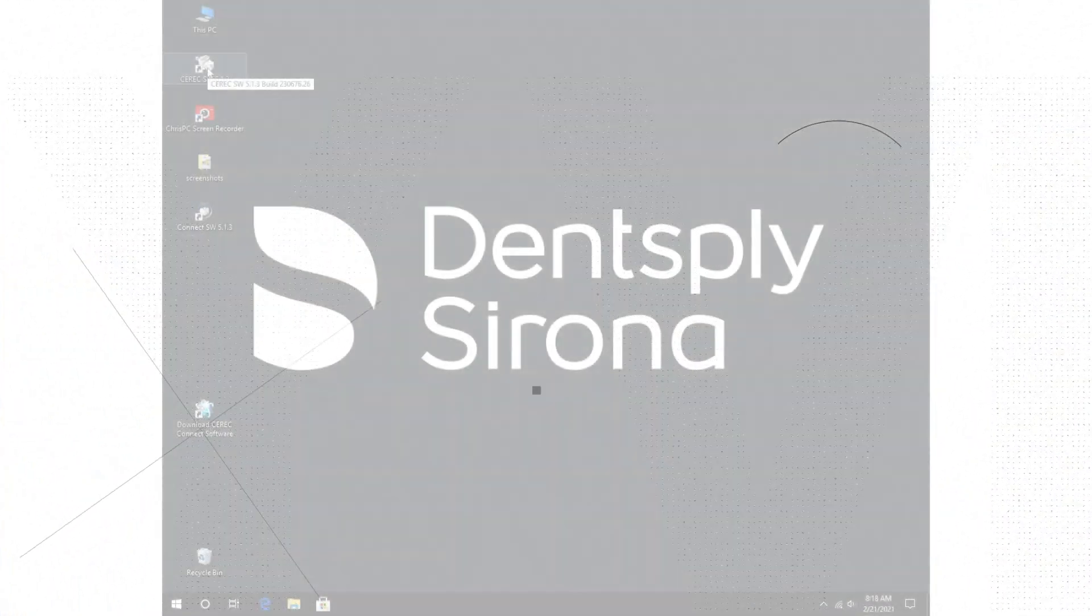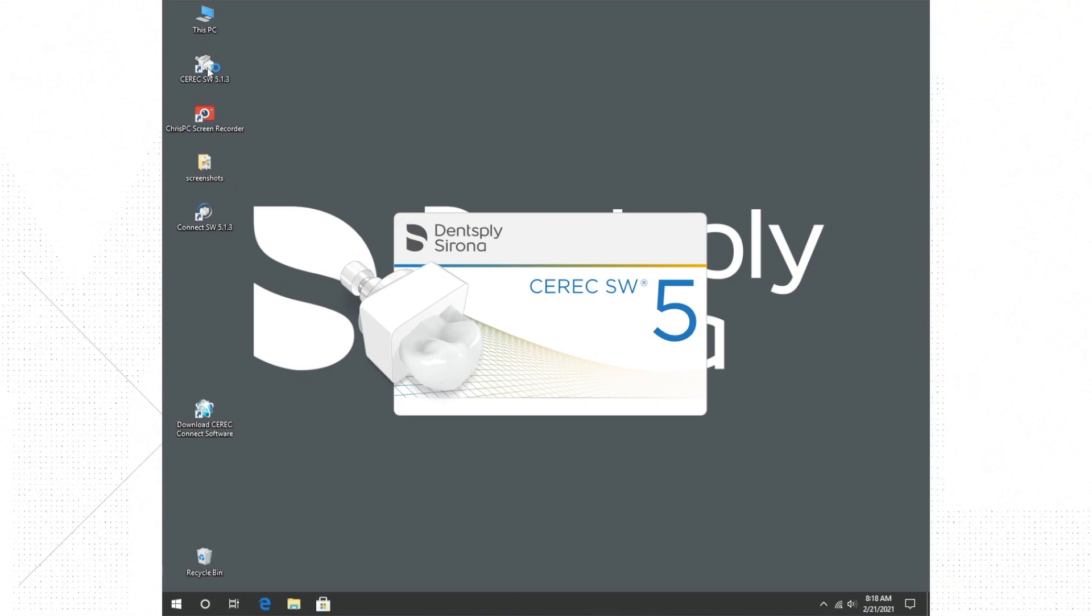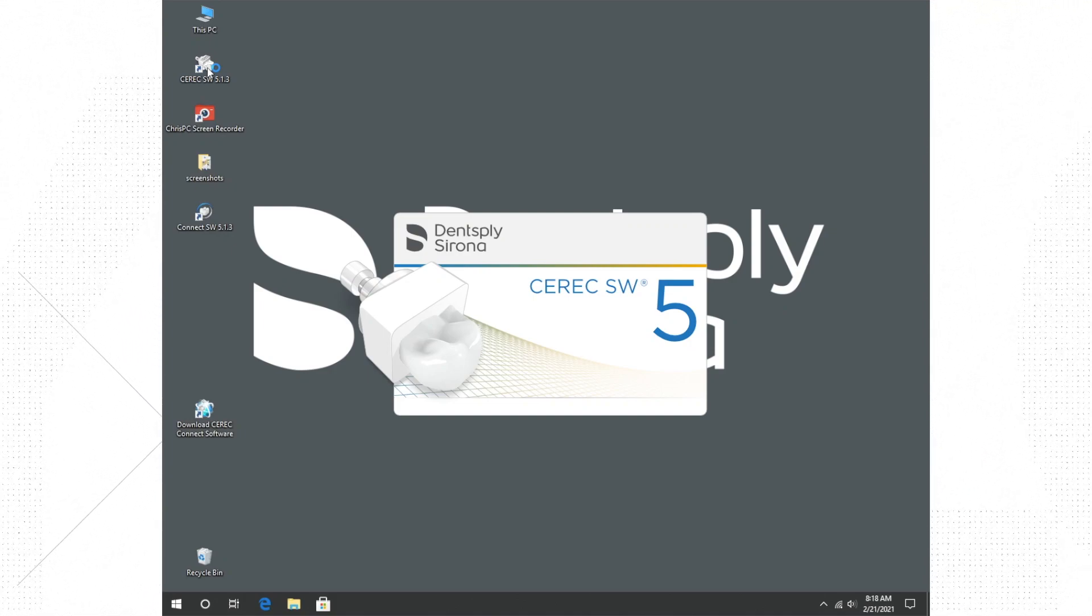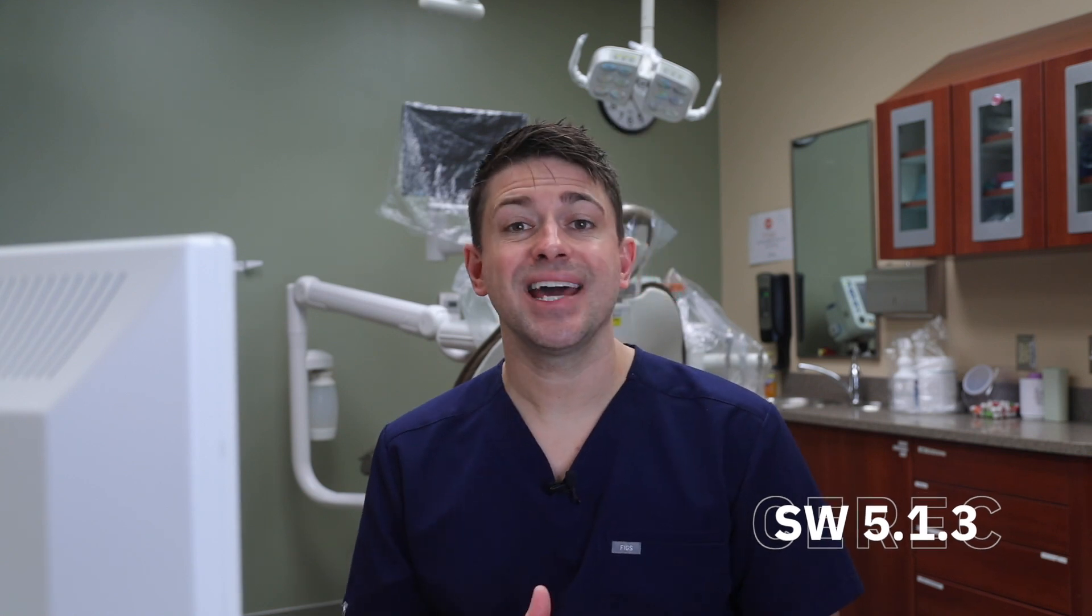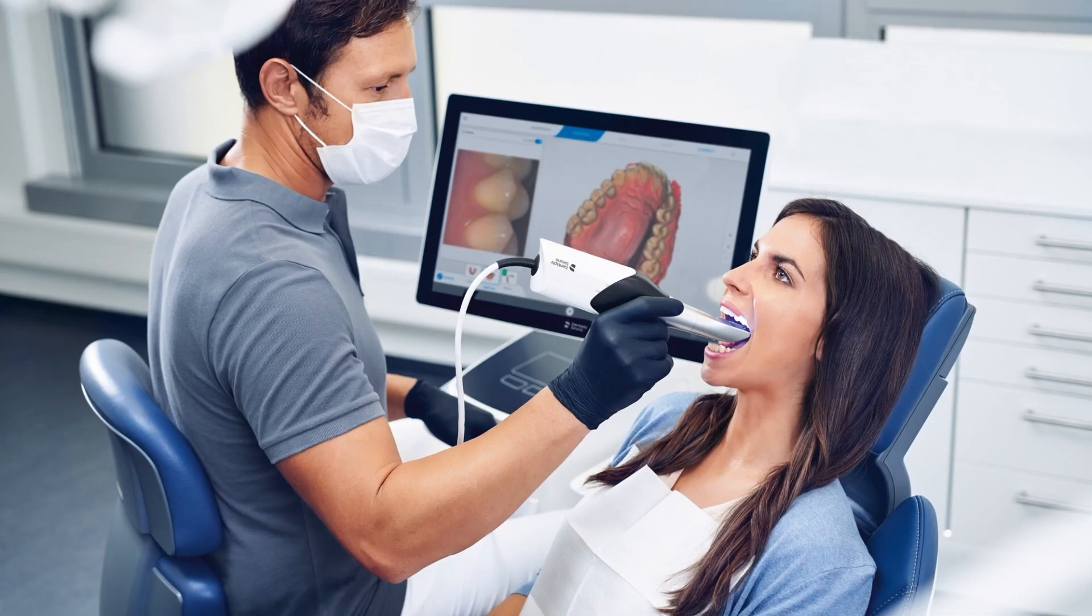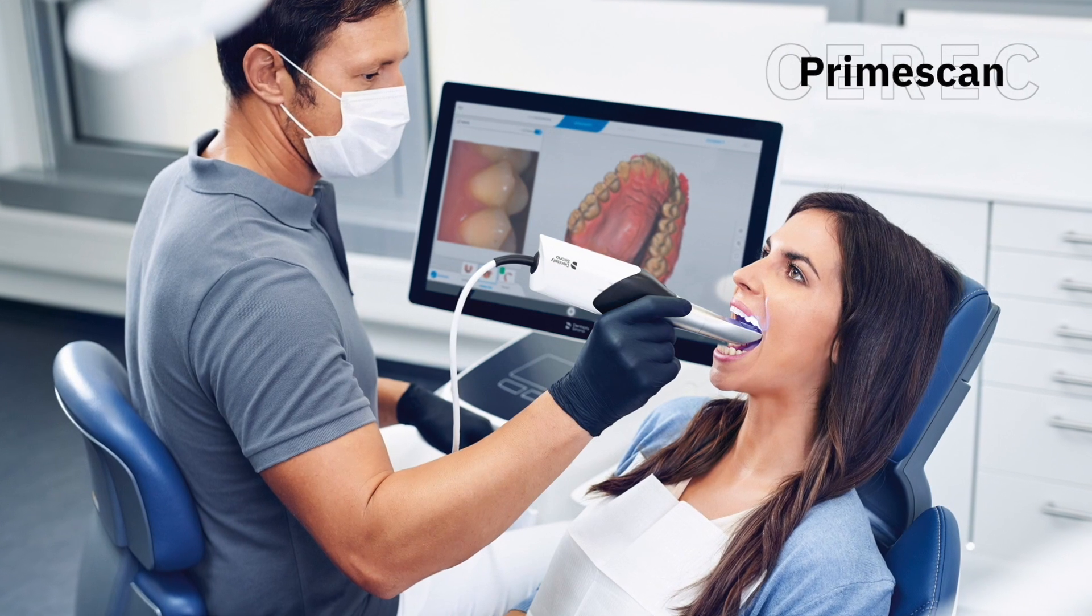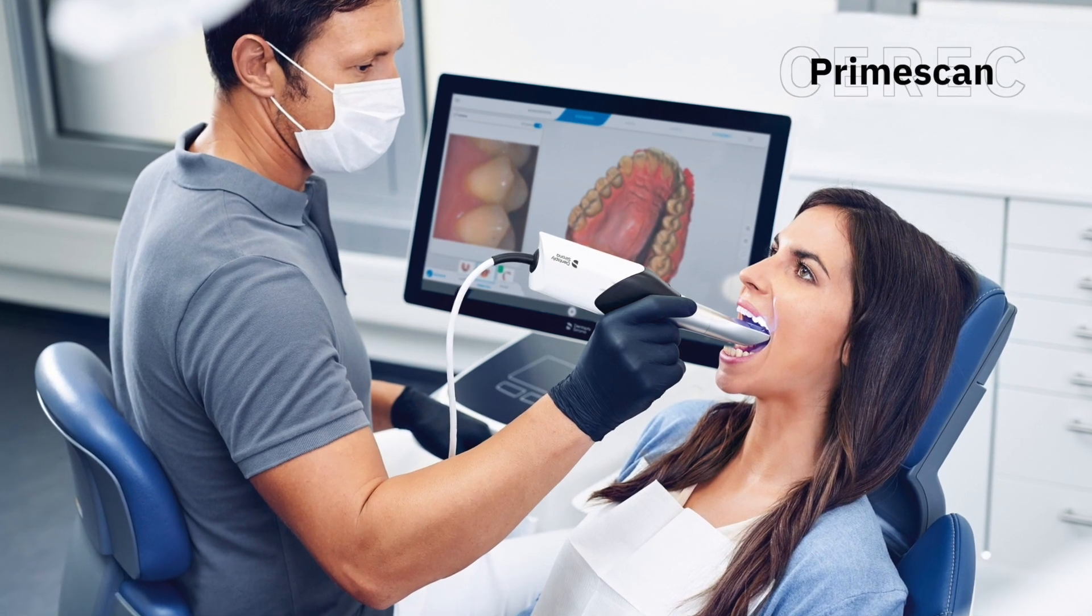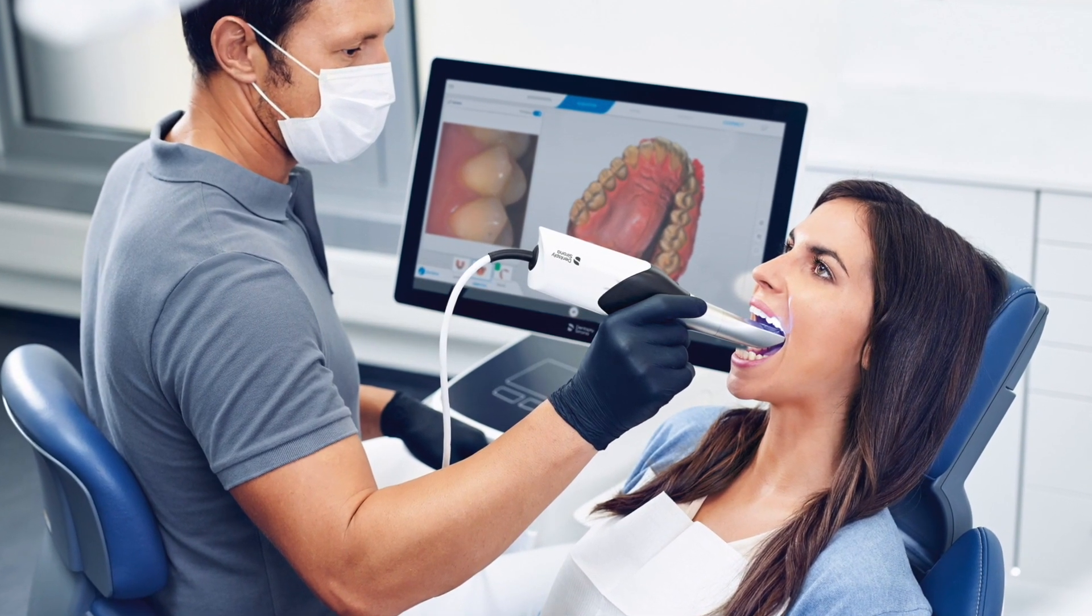At the time of this recording, we are running software version 5.1.3. Of course, Sirona now has the CEREC Primescan, which is the latest and greatest replacement for the Omnicam. Minus the upgraded camera and touch screen, the software that we will be using looks identical to the Primescan machine.